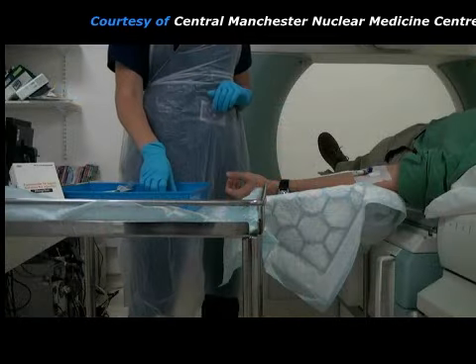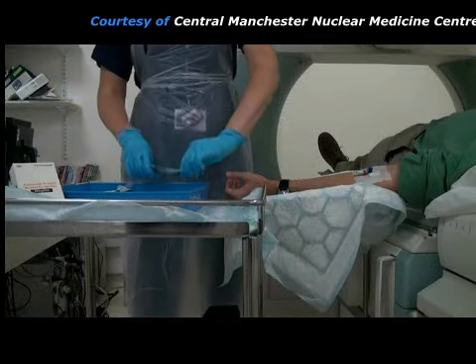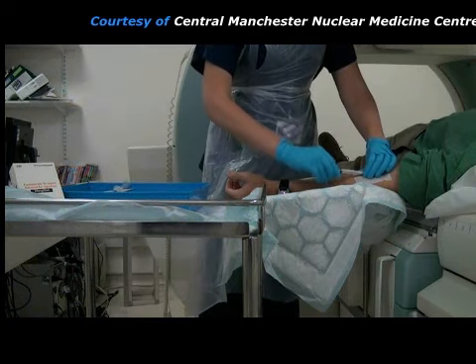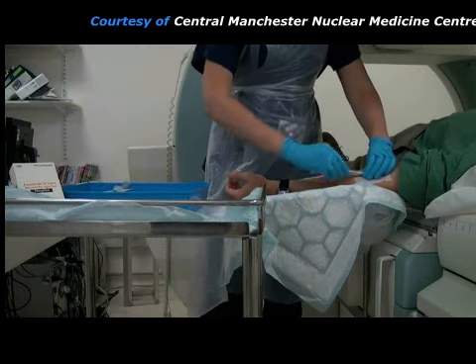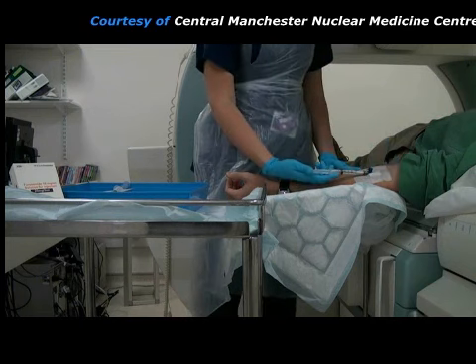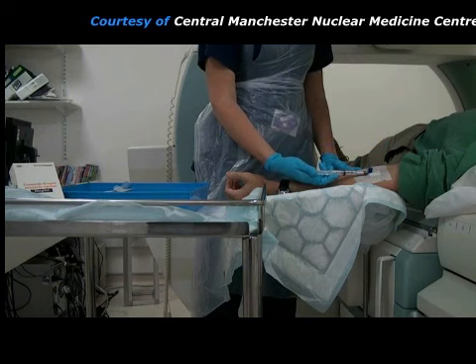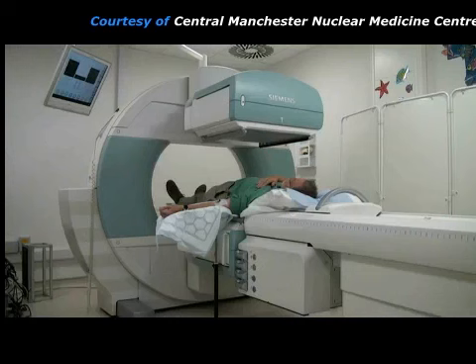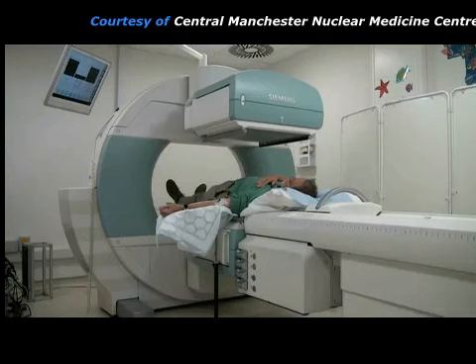Sometimes it is necessary to give an additional injection of a diuretic part way through the renogram. It can be injected through the same needle that is already in the patient's vein. After the diuretic injection, the renogram acquisition continues for a further few minutes.